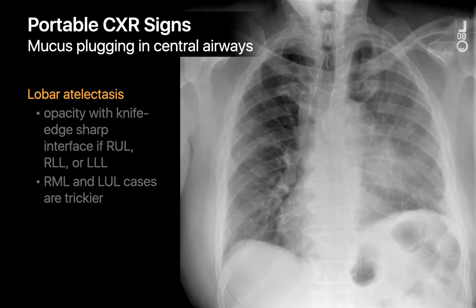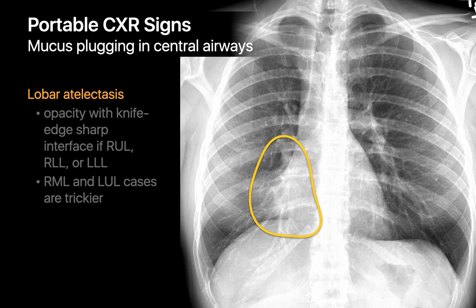Obstructive left upper lobar atelectasis is trickier to pick up on a portable chest x-ray. The imaging features are an acute decrease in left lung volume and homogeneous apparent increased opacification of the entire lung. Obstructive right middle lobar atelectasis is also sometimes trickier, since it can be very tough to distinguish from a right middle lobe consolidative pneumonia.